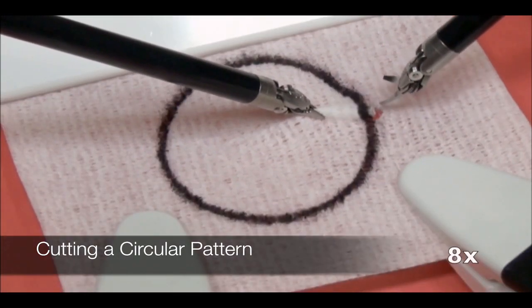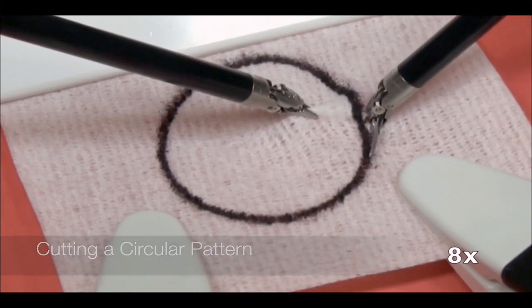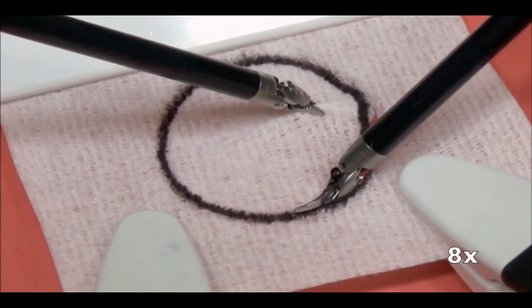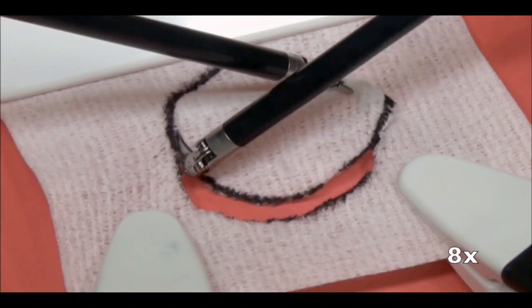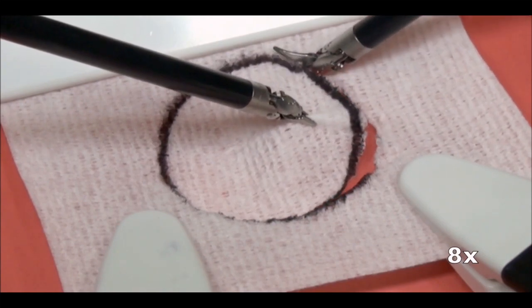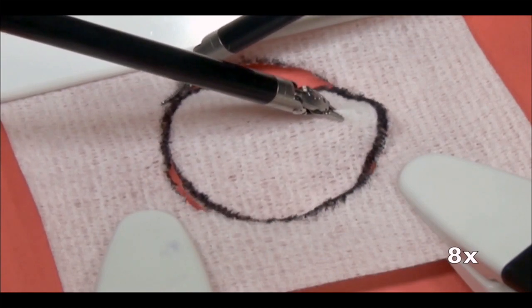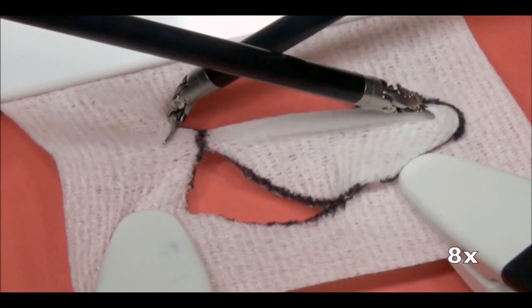This subtask is from a laparoscopic surgeon's training kit, cutting a circular pattern from a sheet of gauze. A computer vision system identifies the circle and guides the robot to cut along the lower and upper halves. The second gripper stretches the gauze, while the first gripper cuts the pattern. In 20 trials, the robot achieved a 70% success rate with a 99.89% cutting accuracy in successful trials. The video is sped up by a factor of 8. The robot is currently half as fast as human experts.